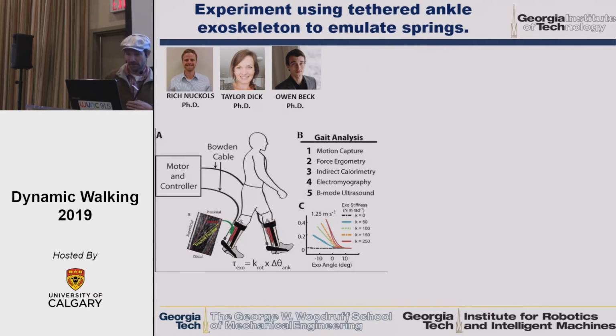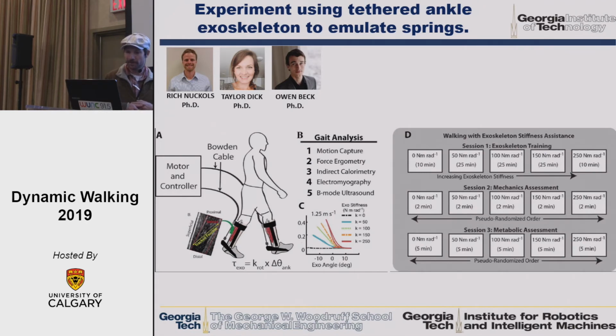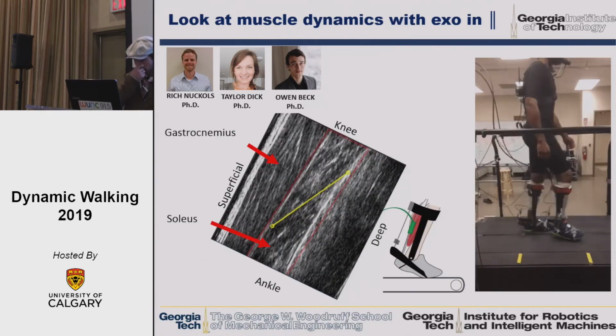And we did a full gait analysis, but we included ultrasound imaging. We think we were pretty careful about getting enough training and things, but after hearing some of the talks here, maybe people weren't fully adapted to the device, who knows. We had a training session, and then we assessed mechanics and energetics on different days. And key here was the ultrasound.